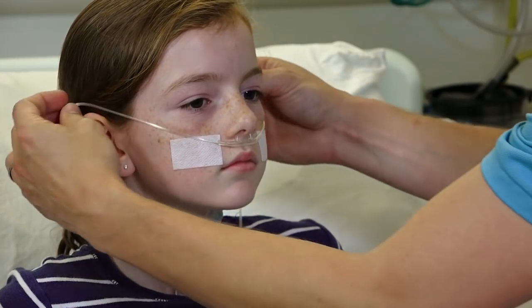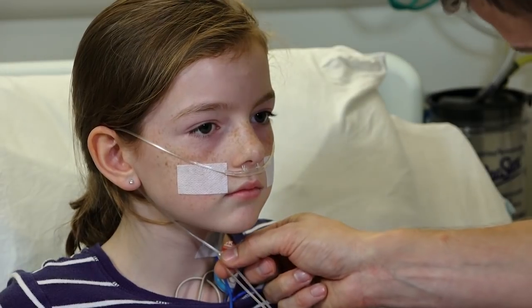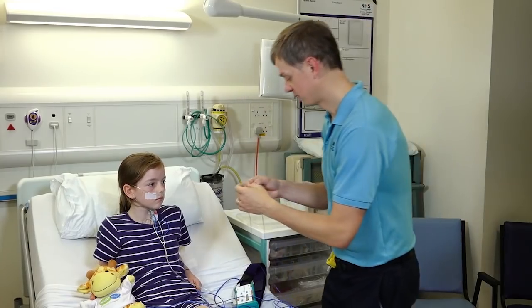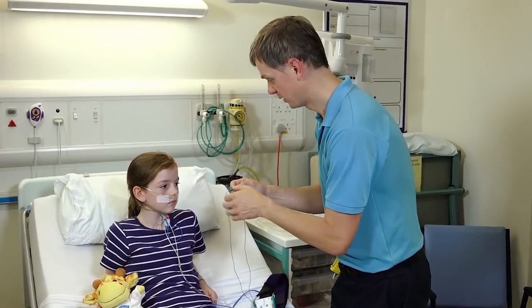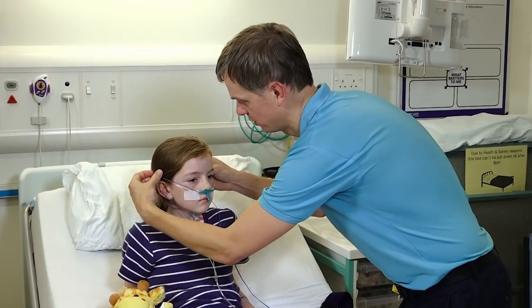Here's the first one — it's quite a soft one. It just feels tickly because it's next to the hairs on your nose. This is the one that does the temperature sensor. It just sits on top of the one you've already got there. It has one for each nostril and one that sits a wee bit lower next to your mouth, but it shouldn't go in your mouth.